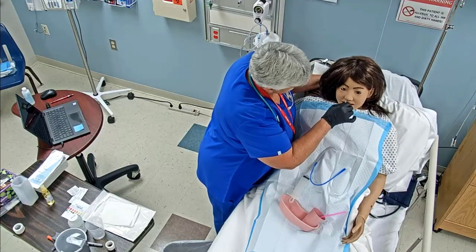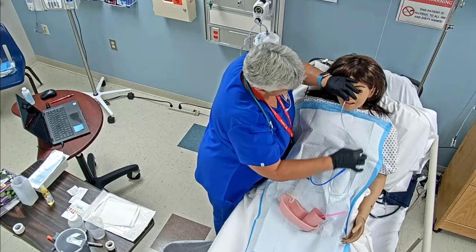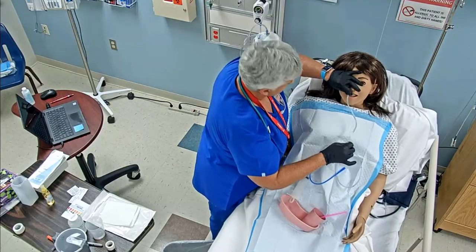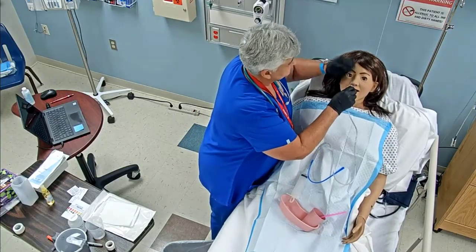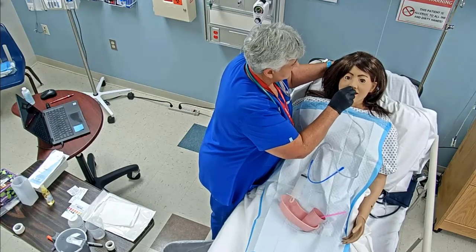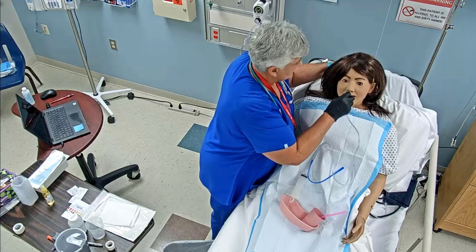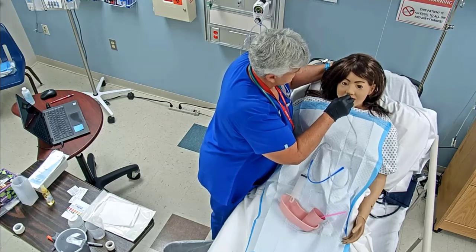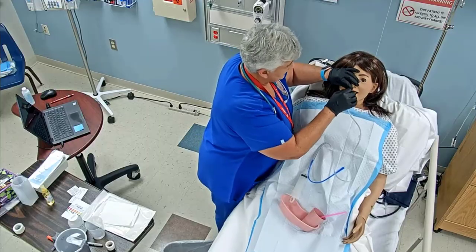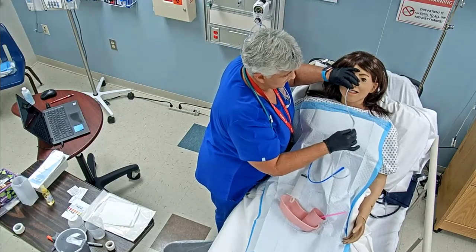Okay, so we would do that until we get to our tape here. Some of our mannequins don't let you go all the way in. Let's see. Okay, there we go. You just need to twist a little bit here. Every time you took a sip and you swallowed, we would advance until we got to our marker.